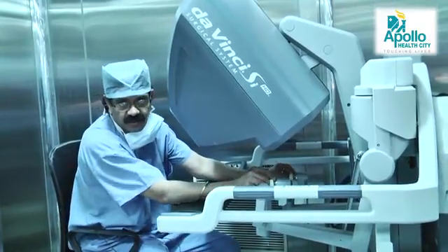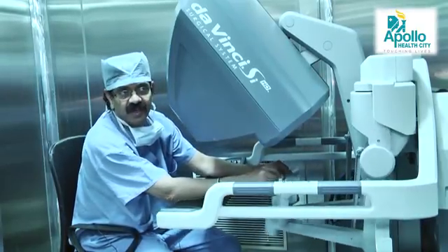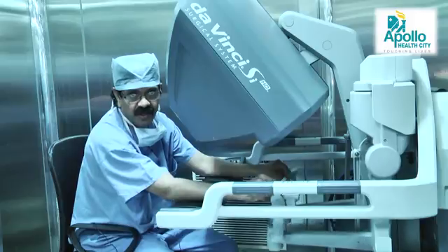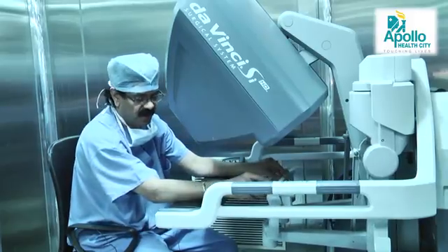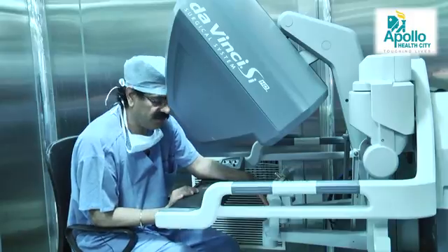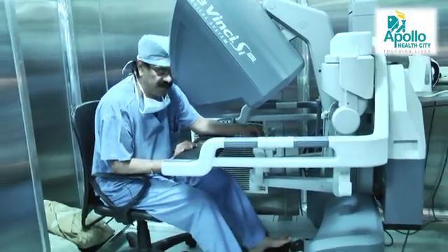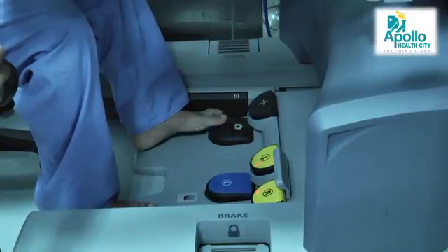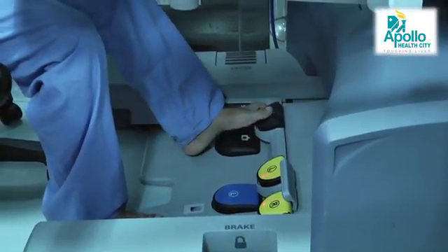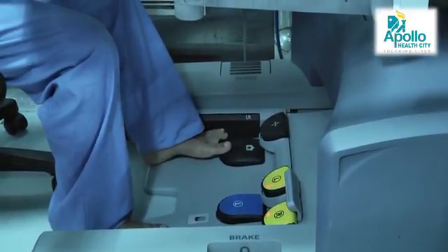These are the controls. This is the master control — movements made outside the body are replicated inside the patient's body through the robotic arms. At the bottom you have various switches of different colors: this is the monopolar current, this is the bipolar, this is the master control for the camera, and this is the master control. The whole system is controlled from here, and on my left hand is the arm-change control.